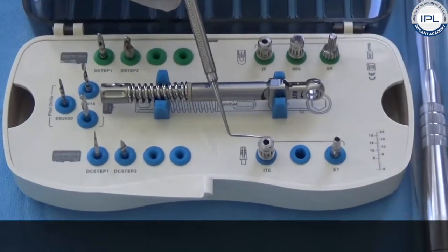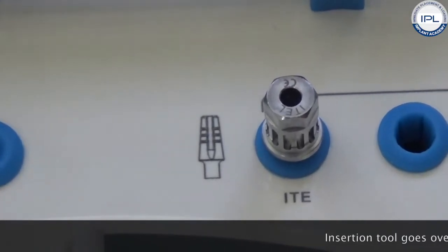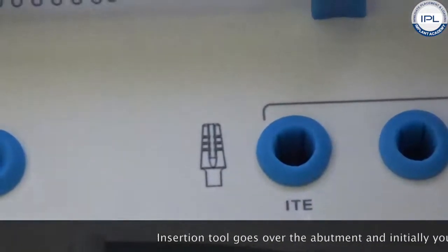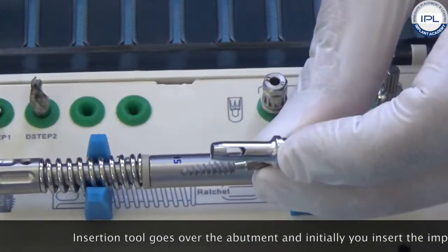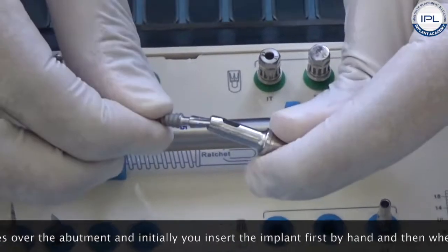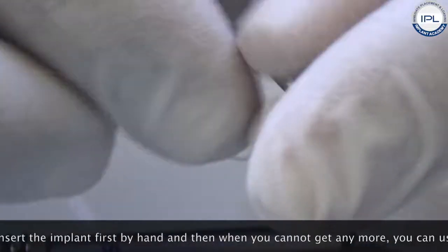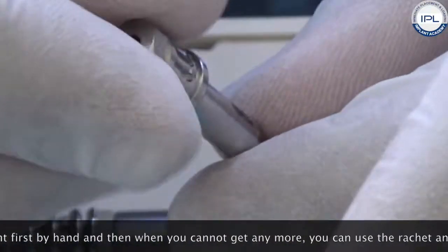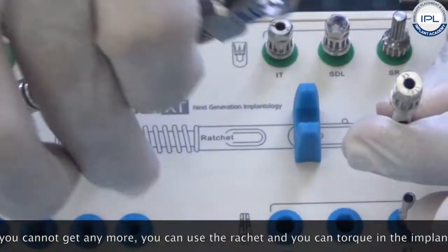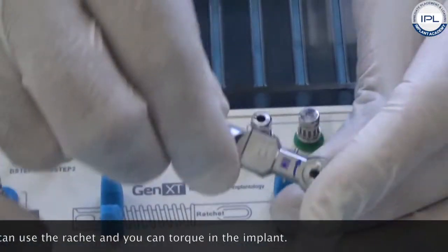Regarding the insertion of the implant, this is the insertion tool. The diagram is made for the external connection for the single-piece implant. The insertion tool goes over the abutment, and then initially you insert the implant first by hand. Once you cannot go any further, you add the ratchet and you can torque the implant in.